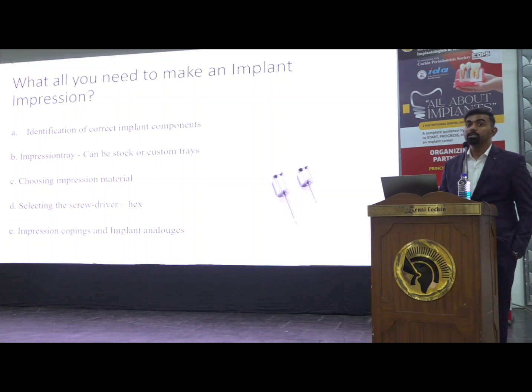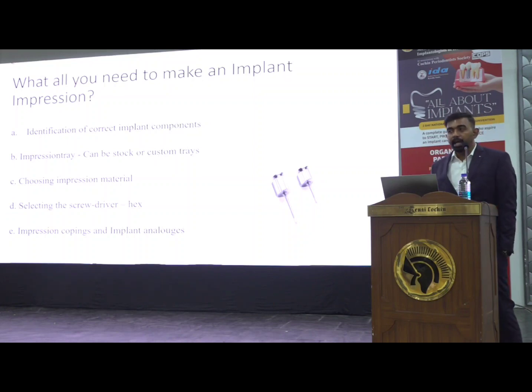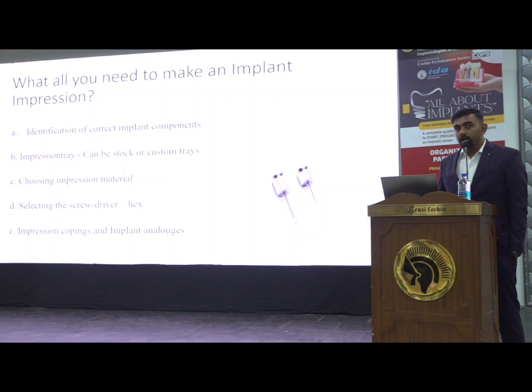Polyether can be used if your implants are parallel only. Addition silicone can be used in all cases, along with if your implants have 15 to 30 degree angulation. Addition silicone is available in multiple viscosities. That's why it is the gold standard.